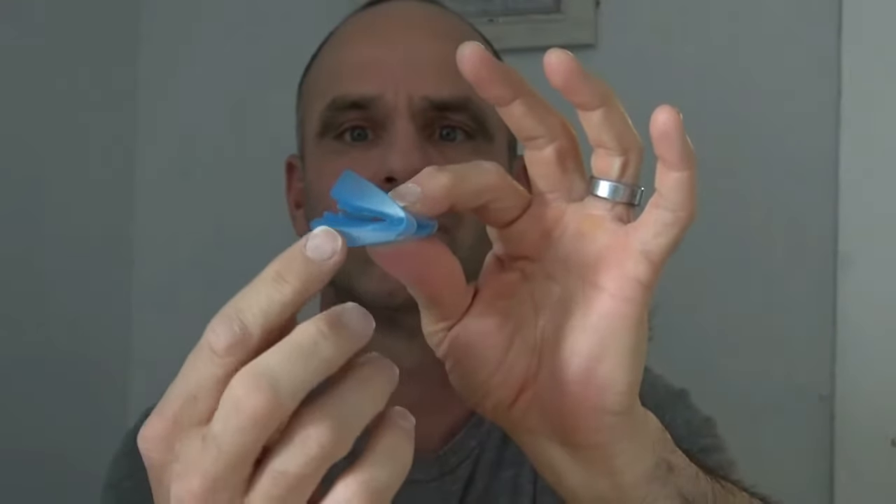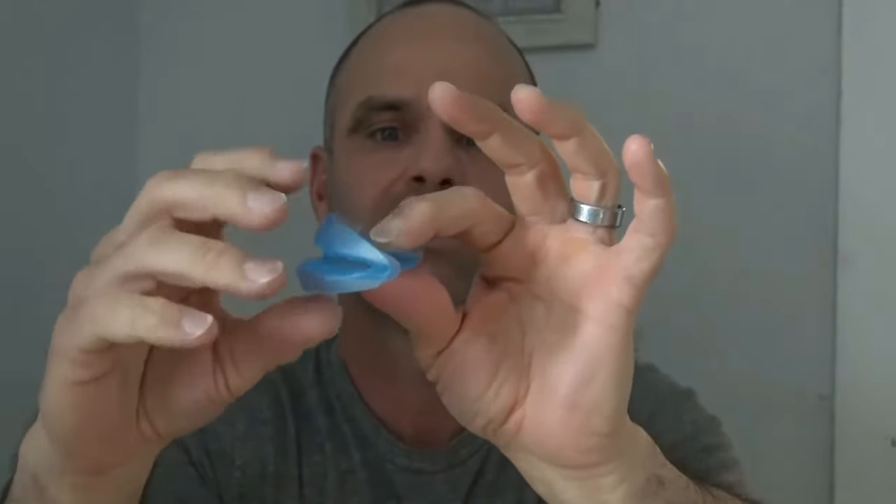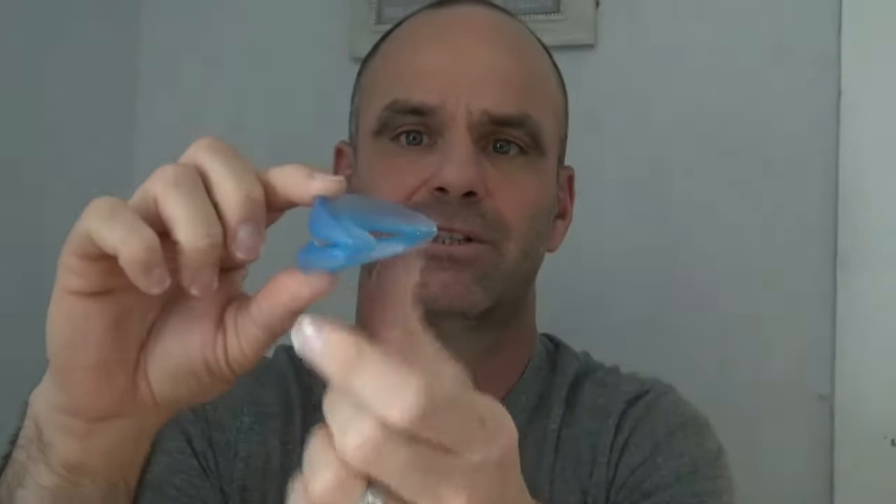The theory behind Z-Quiet is that all stop snoring mouthpieces hold the lower part of your jaw out past your upper jaw — you can see the difference there. Z-Quiet's in a class by itself because they actually have a patent for the living hinge.